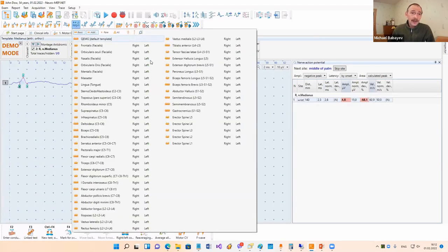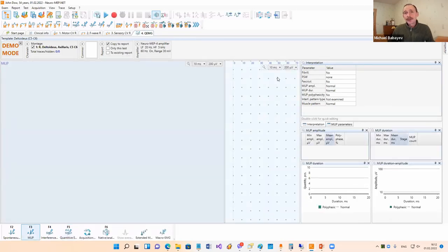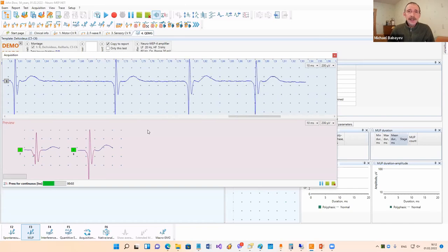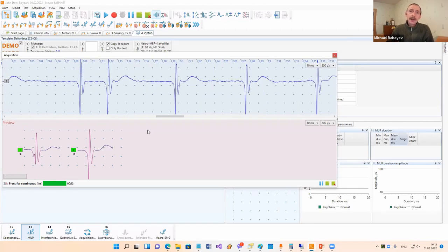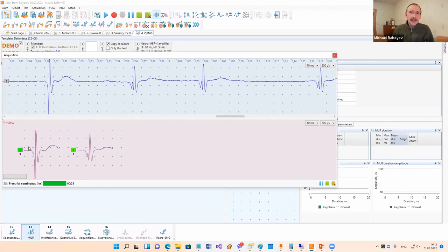Then we can go to needle EMG and select quantitative EMG - for example, deltoidus. Here you can record spontaneous activity, motor unit potentials, and interference pattern in one test. Now we'll go to motor unit potentials. If you don't remember where to insert a needle, you can press F1 and see this information. Then we start acquisition. By default in our system it is automatic mode. The doctor only needs to place a ground electrode, insert a needle, and ask the patient to make a small muscle contraction.